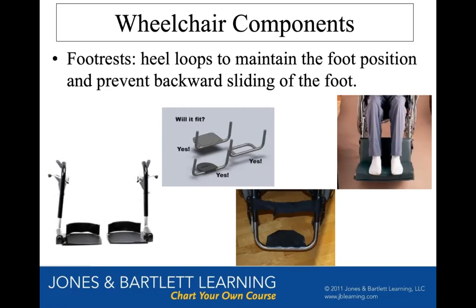In some of them, they can elevate so that you can sit in the chair with a leg elevated. And power chairs can also have leg rests that come off. Some power chairs have power elevating leg rests, where you can just hit a button and your leg rest elevates. So if you have some swelling in your ankles, you could tilt your whole chair back, and elevate your leg rests, get rid of all that swelling.